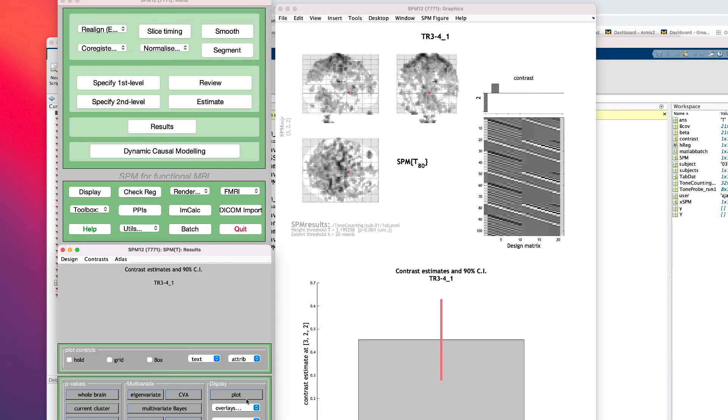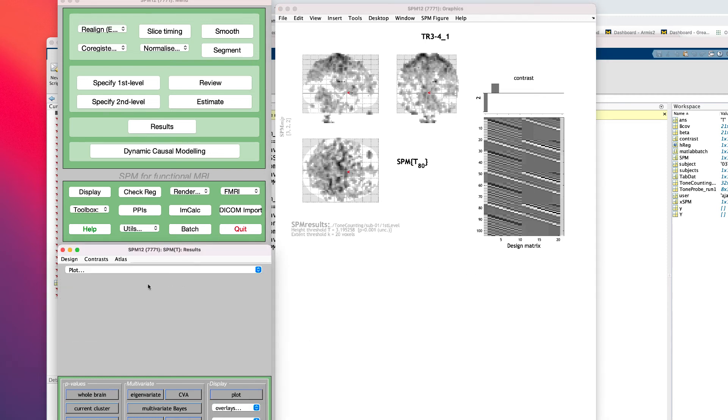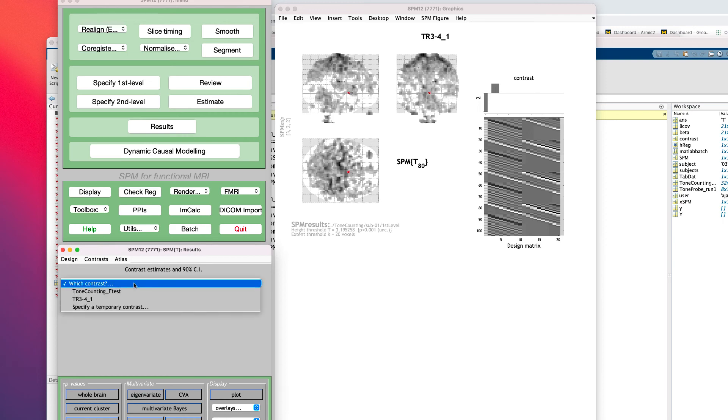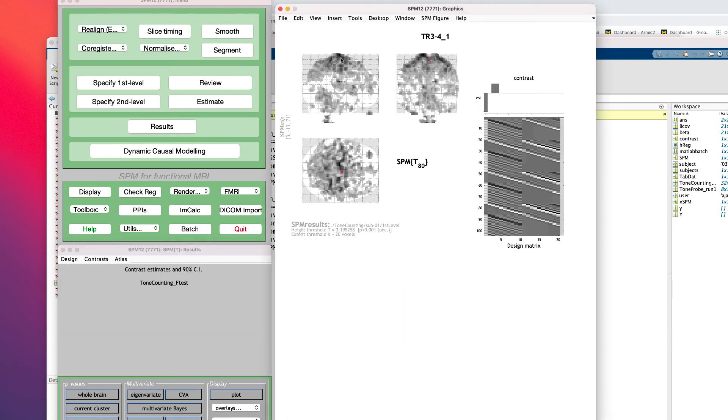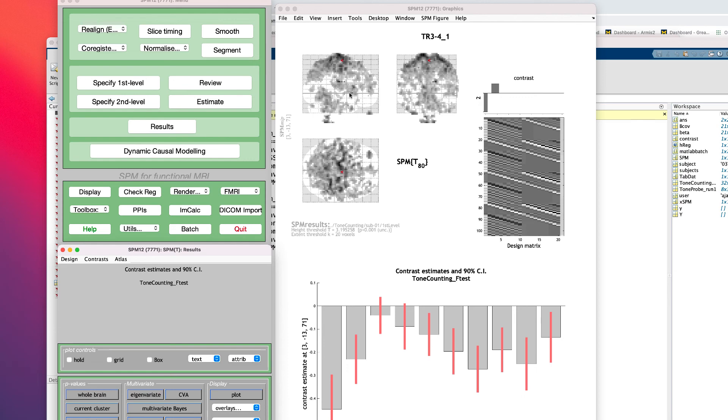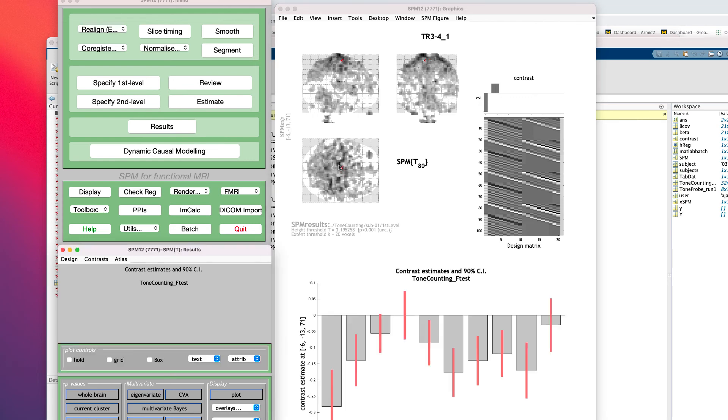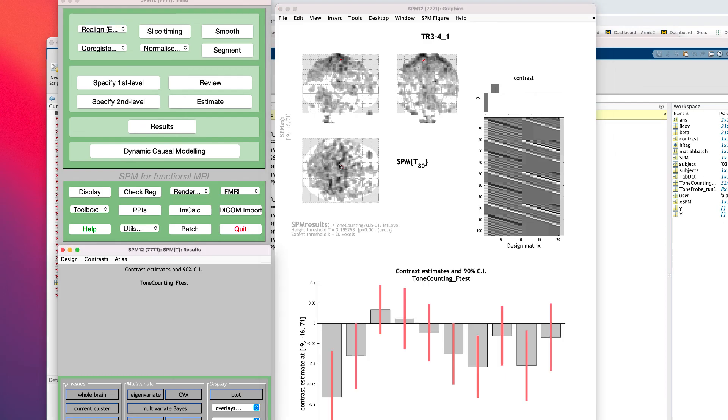To see what's driving this effect, you could also plot the contrast intervals for the F-test. For example, in some voxels, TRs 3 and 4 are slightly negative, but at least they are more positive than TR number 1.